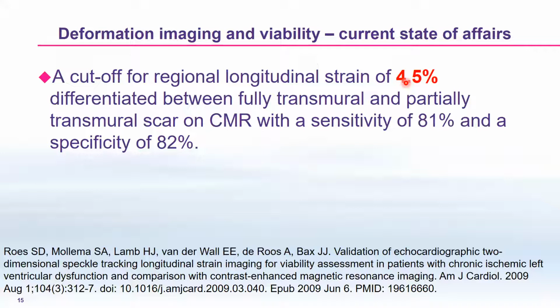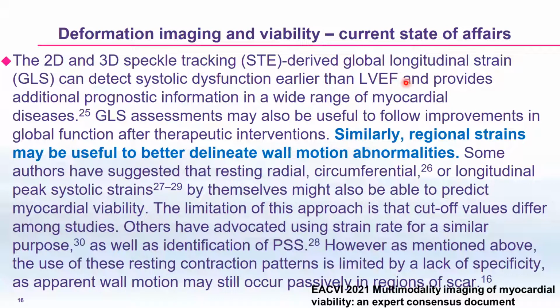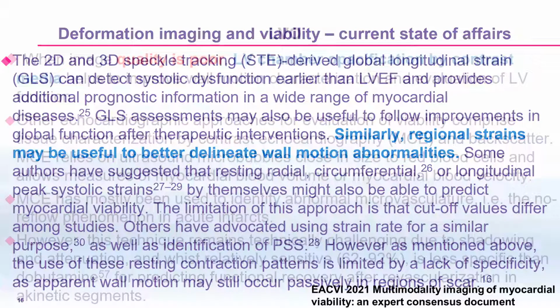I suggest, if you have the time and if your machine is good, when you do the dobutamine stress testing, you always have an ECG attached and you always store the images. So I suggest, if you have the time, to try to run the speckle tracking and to do some GLS, because sometimes the GLS may show something that the eye does not catch. So it's a good idea to start practicing that, although it is still not the standard. The standard is just the dobutamine stress testing.